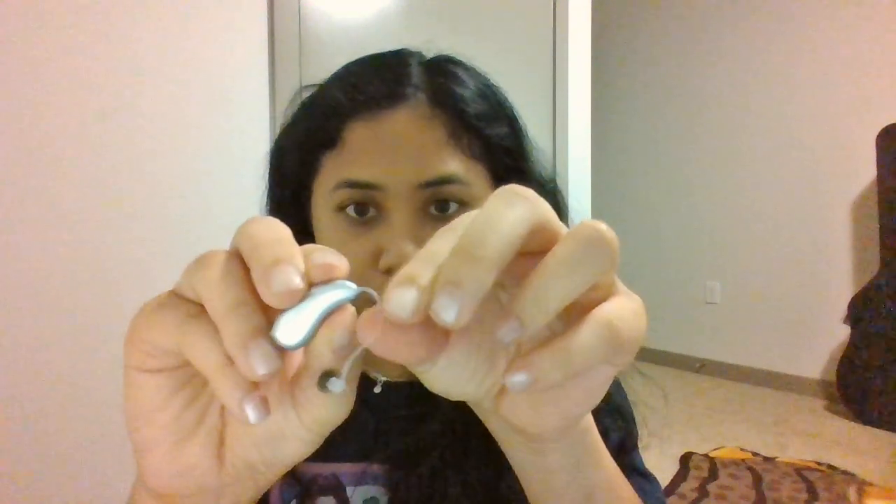What you would do is replace the slim tube. Very gently, you would hold the end of it and take it apart. Then you would take a new slim tube, put it back in, and make sure it's secured. When you do that, make sure you fit the end of the slim tube with a brand new dome.